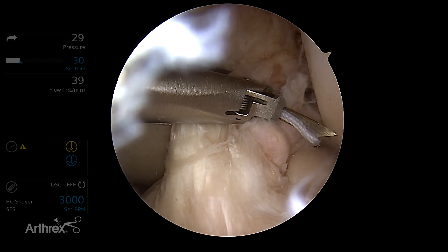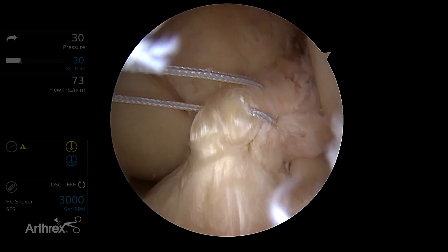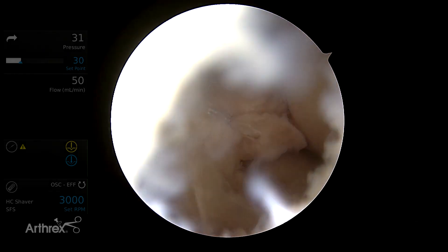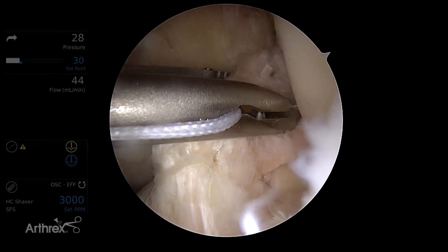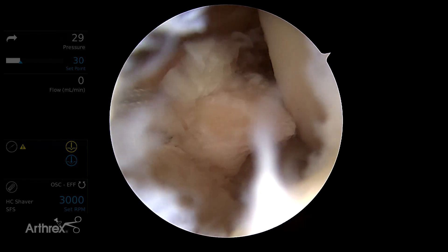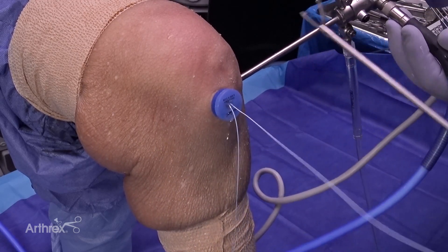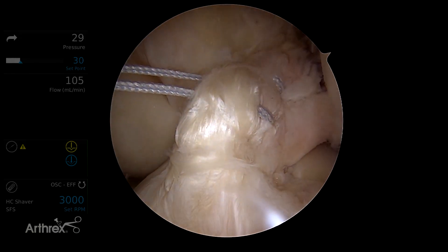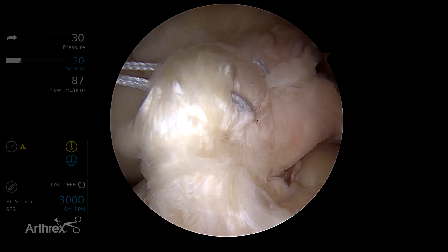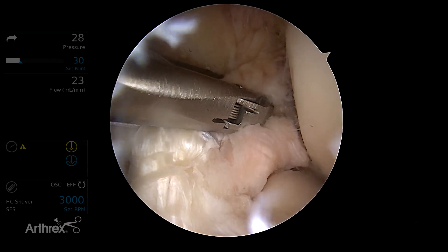Another thing is as you get higher up the ligament, you want to angle your scorpion as you pass so that you don't jam the needle into the wall. We've already taken two or three passes going up, so you can get quite a number of good passes for these type 1 tears. Occasionally, if the tissue is really frustrating and it's starting to pull apart, you can make an accessory incision above your medial portal and insert a grasper to hold the ACL on tension while passing your stitches — a nice trick if the ACL is starting to fray with each successive pass.